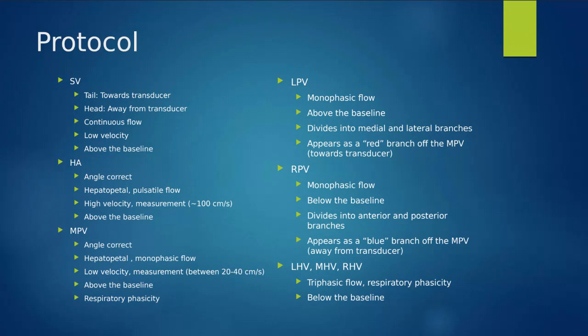This is when the blood is trying to get into the liver, and when it's getting kicked out. So we're seeing that bidirectional flow or that flow reversal in those cases. And if you look really closely, the vessel mainly is appearing red, but you also have these areas appearing blue. So we're seeing the color representation of that flow reversal as well.